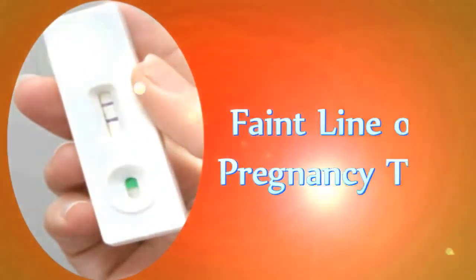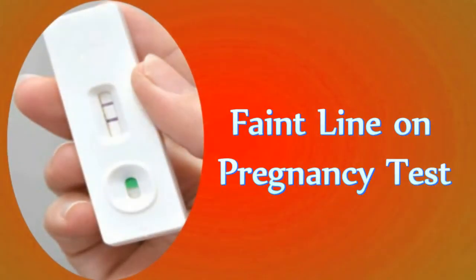Faint line on pregnancy test. A faint line on a pregnancy test result means that the test has found pregnancy hormones in your urine. Home pregnancy test kits are commonly available in drugstores. These test kits offer privacy, convenience, and fast results.